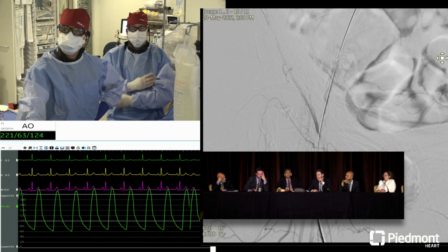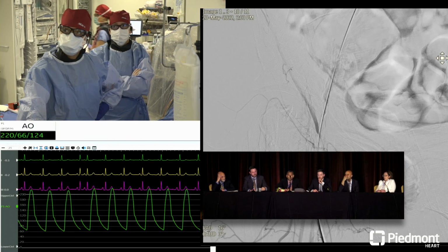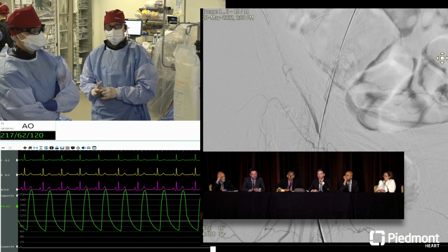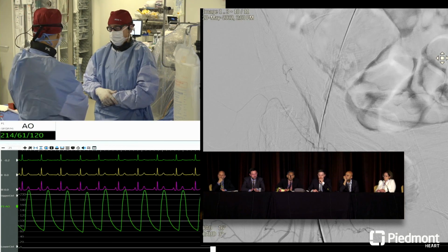We do have the ICE trial showing some benefit of self-expanding stents in there, head-to-head. I don't like self-expanding up in the common iliac, but definitely down here, I agree with you, Eric. There's a lot of compression, a lot of movement, and definitely on CT, it's three-dimensional. It's coming straight up at you.